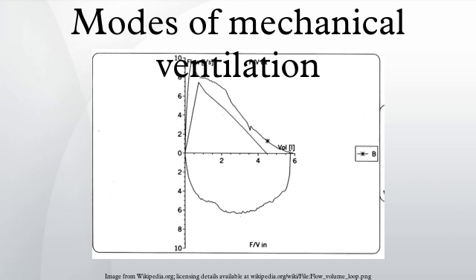Other ventilation modes and strategies, closed-loop systems, adaptive support ventilation. Adaptive support ventilation is the only commercially available closed-loop mode of mechanical ventilation to date that uses optimal targeting. This targeting scheme was first described by Tehrani in 1991, and was designed to minimize the work rate of breathing, mimic natural breathing, stimulate spontaneous breathing, and reduce weaning time.